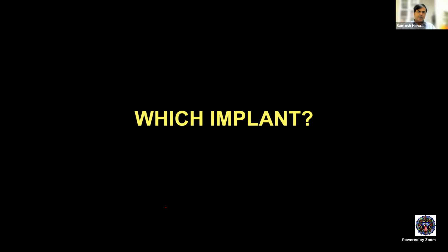Tuju? Sir, porous, non-porous implants? That's a very simple classification. Porous, non-porous. Do you want to be more specific? Would you get full marks by saying that? If you want full marks in the viva for this question, how do you answer this? Sir, synthetic, based on the material, PMMA, silicon.